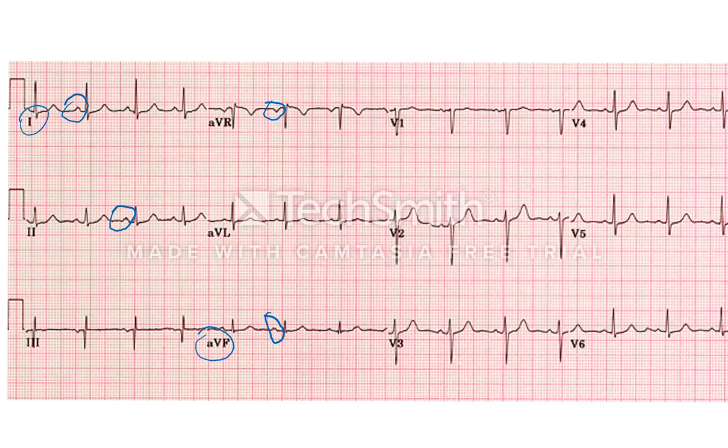We also look at the QRS complexes, make sure that they are narrow. If they are wide, that implies that it is not proceeding down the His-Purkinje system and that it is proceeding in cell-to-cell depolarization, which is a sign that there is something wrong and it is not going down the usual pathway. And then we also look for T waves after every QRS complex, because that indicates that the ventricle is preparing for the next wave of depolarization. And we'll talk about T wave inversions in another talk another time.